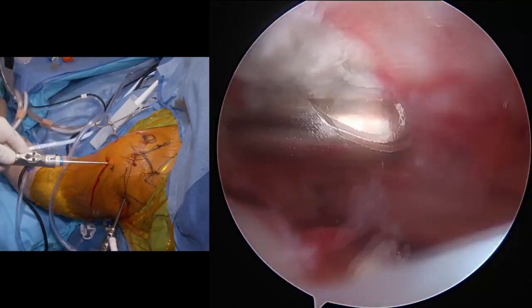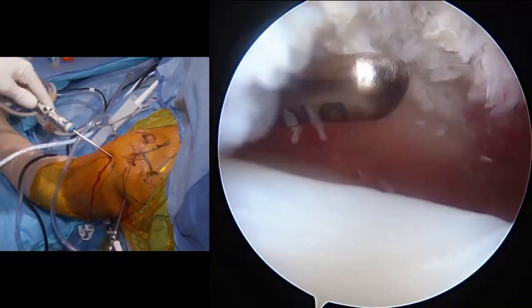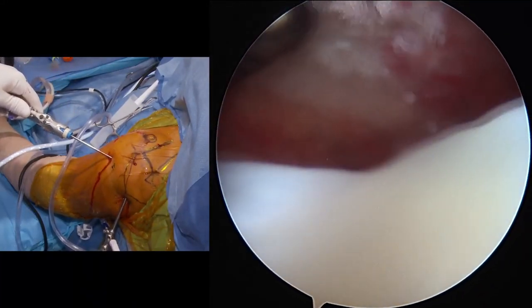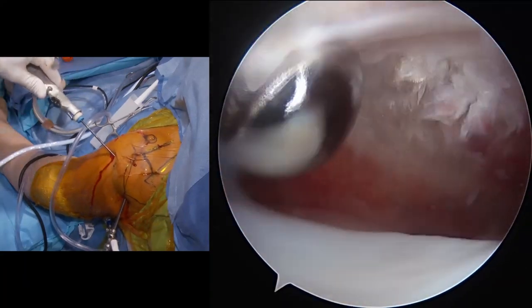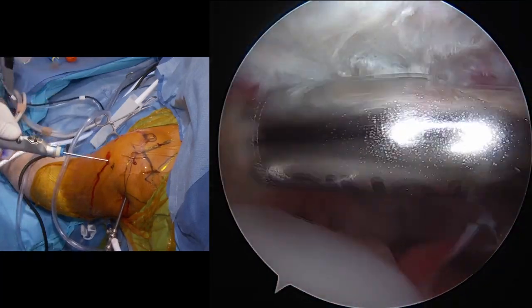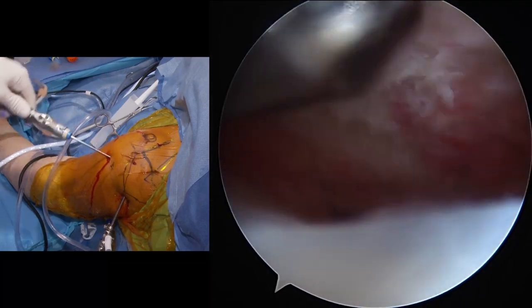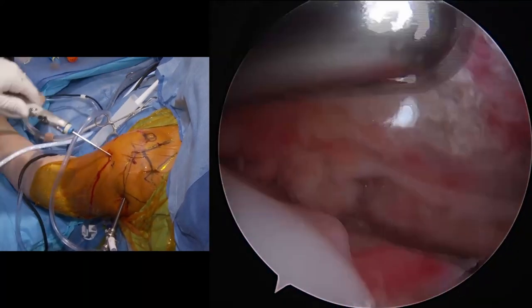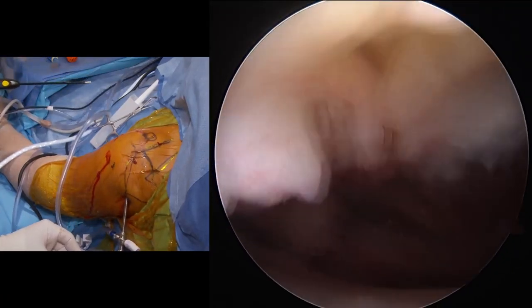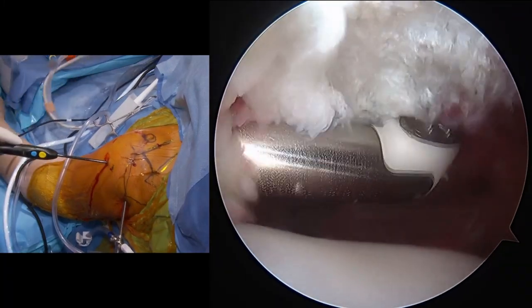Our first goal is to find the lateral corner of the acromion. That keeps us in our orientation, and once we have enough room to start working in this area, we'll take our radio frequency device and peel off the soft tissues so we can see the acromion very nicely. Okay, let's have the radio frequency device. Thank you. Let's get this over here on that edge, and we'll again establish the lateral corner.